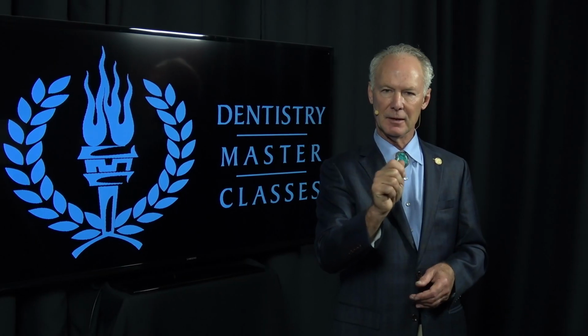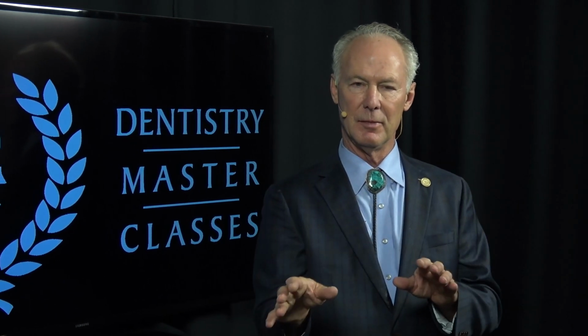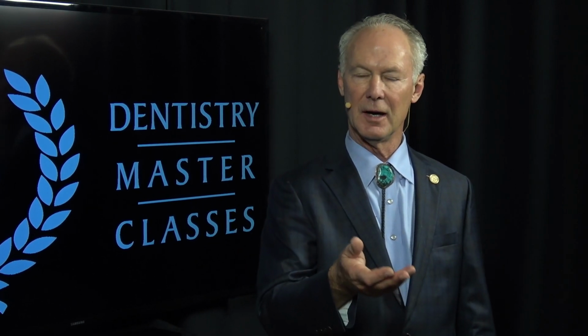The occlusion of the patient moves, wiggles the implant in the bone so that the bone doesn't osseointegrate into the implant. There's a tendency to want to give patients the restoration immediately. Well, I'd rather have success, and so I don't ever do that. You know, we may give them a removable flipper, which is a partial, for a while if they want something. That's what I had with mine. I had a removable flipper while it osseointegrated for 3 months. But if you do it like that, you give it time to osseointegrate, you've got a high success rate.